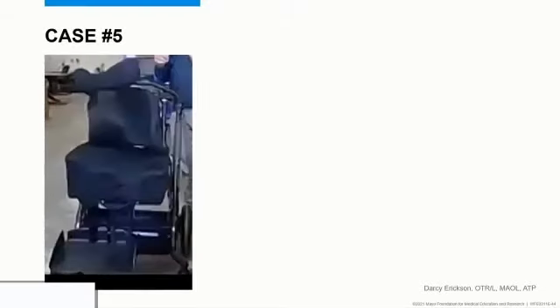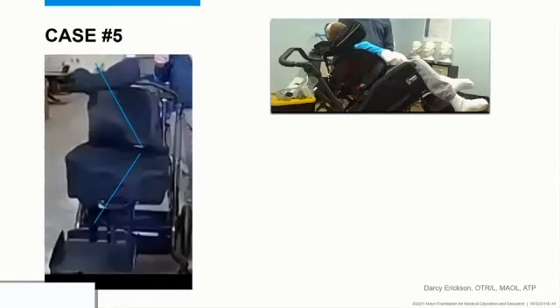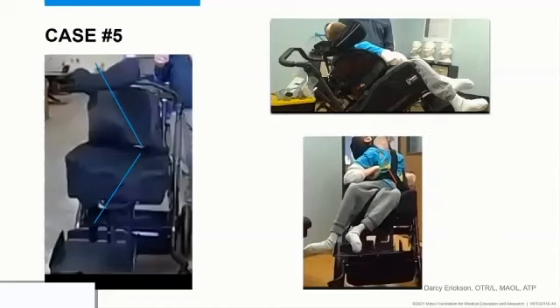So we did a beautiful custom seating system that articulated exactly the directions that he needed to have supported. And it worked great, fit him like a glove, but it ended up being a failure. And can you guess why? Anybody? Any speech pathologists in here? Anybody?